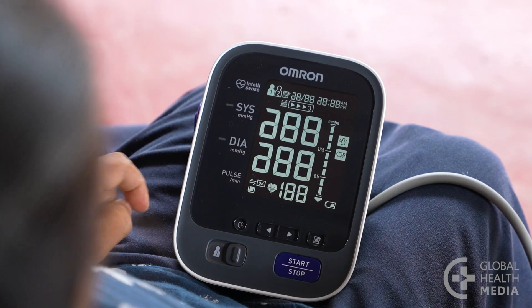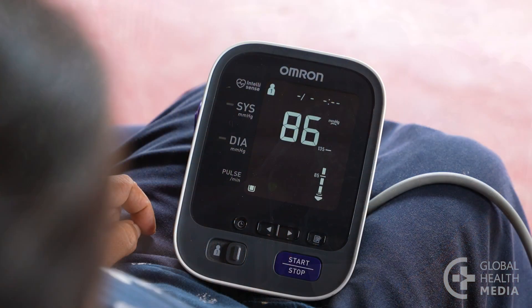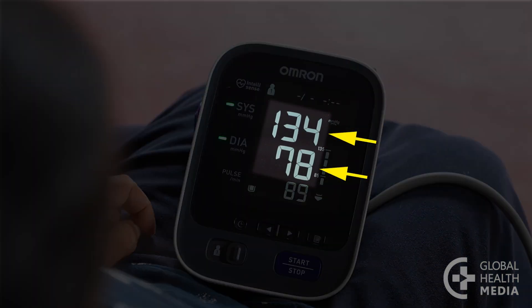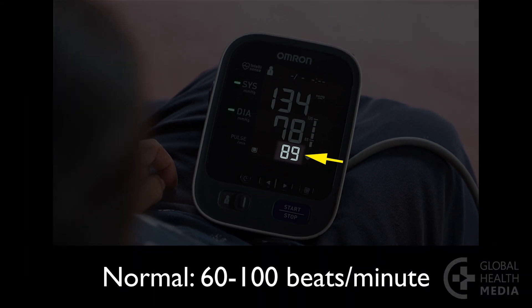Press the button and wait quietly. The first two numbers are your blood pressure. The top number, the systolic, is the pressure when the heart contracts. The second number, the diastolic, is the pressure when the heart rests between beats. The last number is your heart rate. Normal is between 60 and 100 beats per minute.